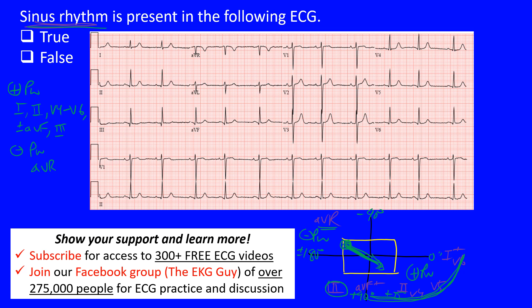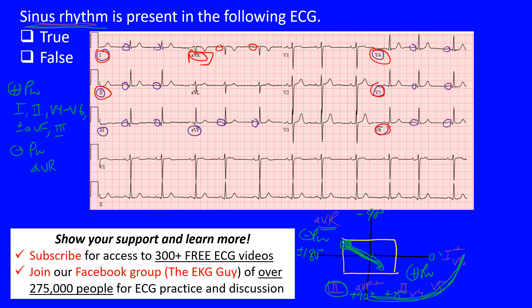Now let's look at the ECG. In lead I we can see small upright P waves — not so easy to see, but they're there. Lead II shows them more clearly. Lead III also shows upright P waves. AVF shows P waves clearly as well. In the lateral leads V4, V5, and V6, small P waves are visible, and in AVR we can clearly see the expected negative P waves.